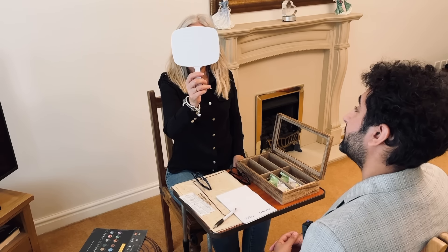Second pair, 50% off. And we'll take the measurements shortly. Now, we've got two large frames for sunglasses. Just bear in mind they don't have the sunglass tint in them yet — that's going to be done at the laboratory. It's more you picking your favourite style. I'll show you some sunglass tints after and what my recommendations will be. So this is called the major frame, colour crystal. Well, I like that size. You'll get a lot of coverage in those. Yeah, I like that one. You've got the extra width, the height. When you go on holiday, do you need to read in your sunglasses? No, I just prefer sunglasses for sunglasses. Single vision, yes — walking around. You don't need to have any reading. No. Okay.